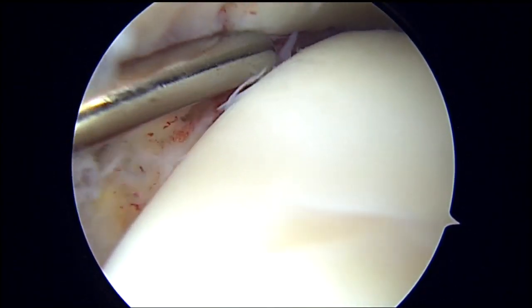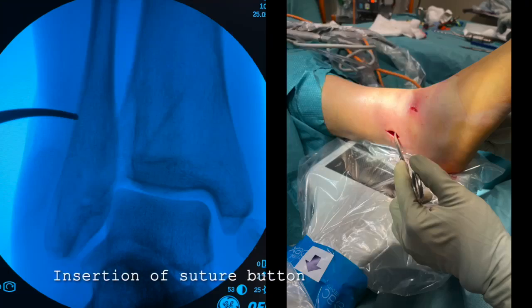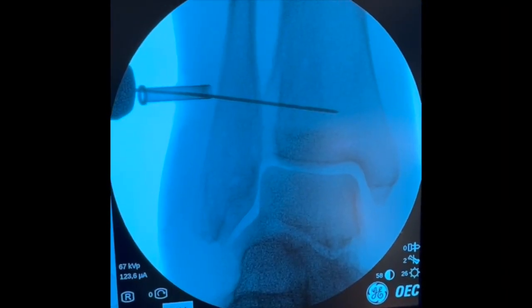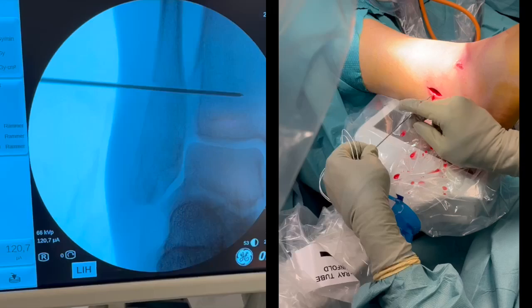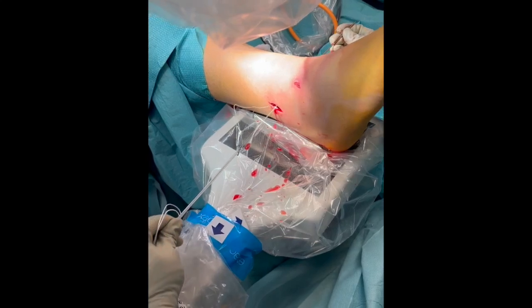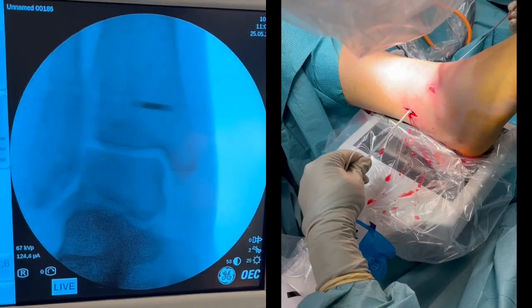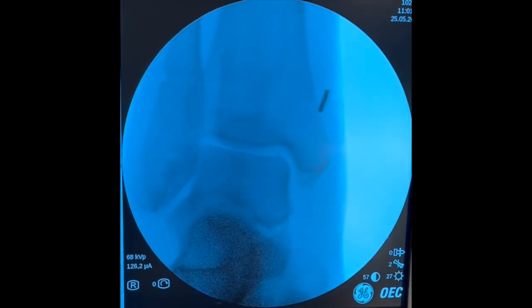In this case the syndesmosis is also secured with a suture button. The level of tunnel placement is identified with the help of a fluoroscope. A guide pin is inserted and overdrilled by a 3.7 mm drill bit. The implant is introduced into the tunnel and pulled through to the medial side where the oblong button is flipped, taking care to avoid soft tissue impingement.